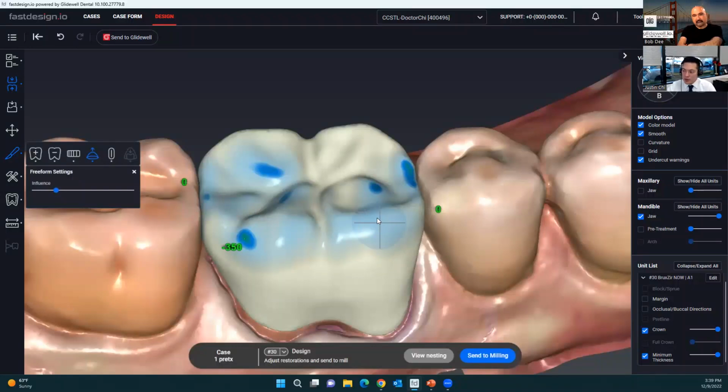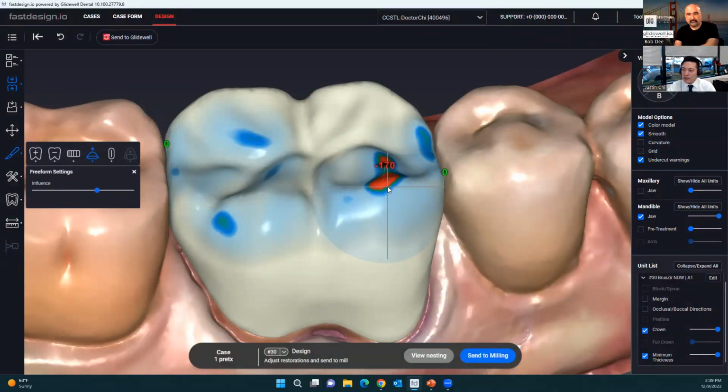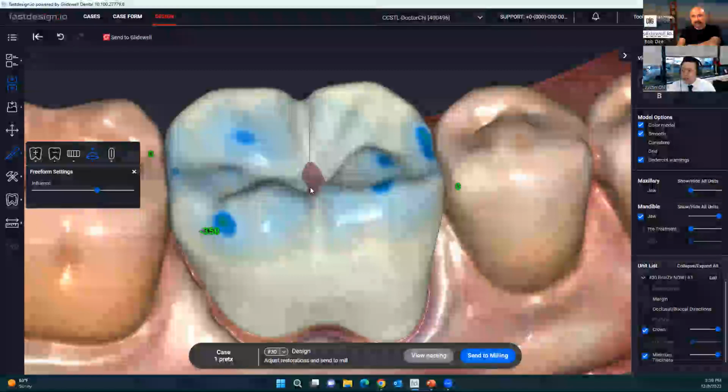And so you'll see there's a bubble when I hover over the design, and I now have full control over it. So I can left click and hold and move that around. And you can also change the size of what you're controlling. So you can control a larger portion, or you can see when I make it smaller, less of the design. And so the software does give you immediate feedback on how any changes are affecting the contact areas. And also, if you go really low, you can also see a thin area begin to form.